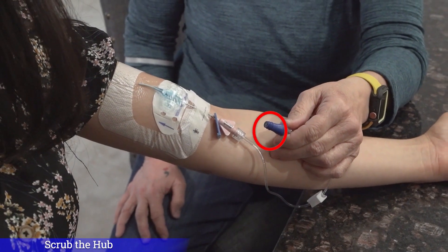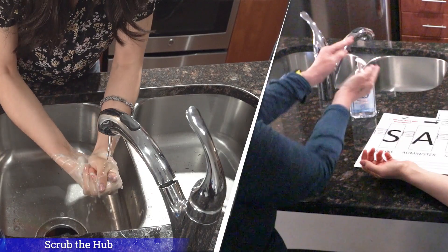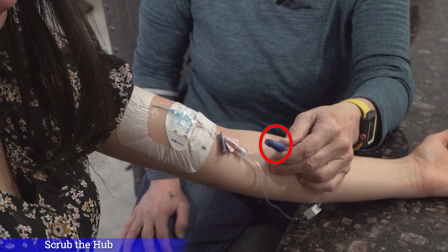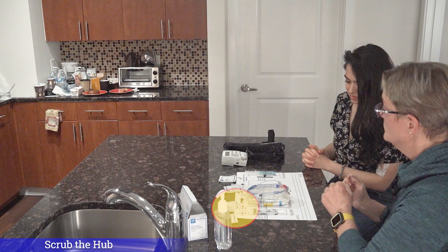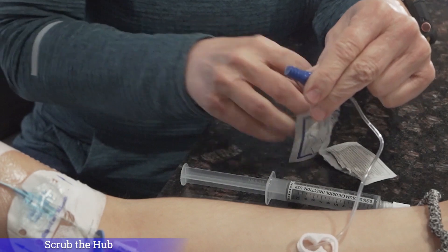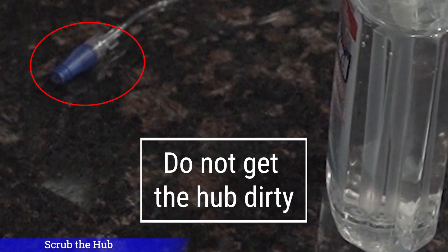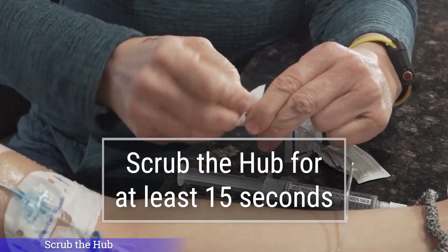But before we do, we must scrub the hub and flush the IV line with saline. But can you guess what comes first? Wash or sanitize your hands. Remember to wash or rub for a full 20 seconds. We will then clean the end cap or scrub the hub on your IV line. To clean the end cap of your IV line, we will scrub the hub by using the alcohol pad located right before the S on your sash mat. Remove the outer wrapping to expose the alcohol square. Wrap the alcohol square over and around the sides of the hub. Scrub the hub with the alcohol square for at least 15 seconds. Throw the used alcohol square in the trash. Once you have cleaned the hub, you do not want to get it dirty by allowing it to sit on a surface or hang loose. But if you do, it's okay — you will just need to wash your hands again and re-clean with a new alcohol square.